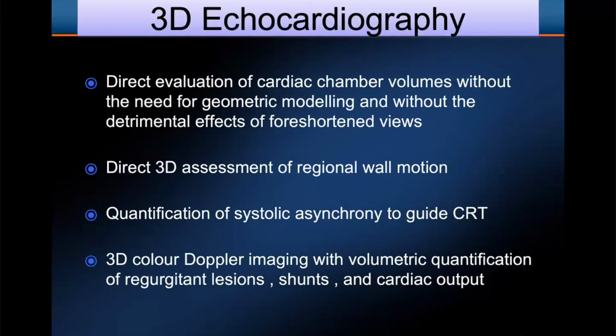Three-dimensional echocardiography could give us direct evaluation of cardiac chamber volumes without the need for geometric modeling and without the detrimental effects of foreshortened views of the ventricles.